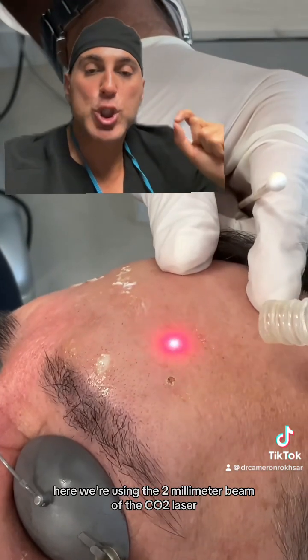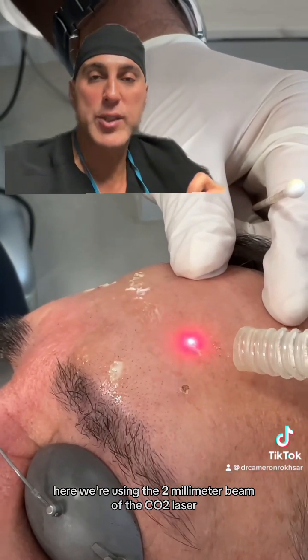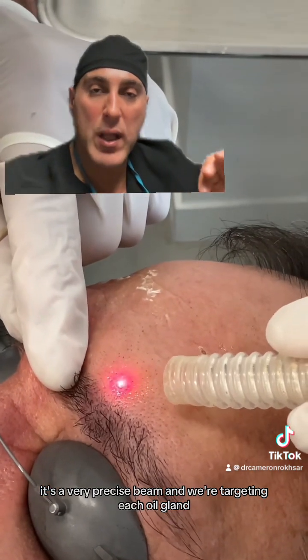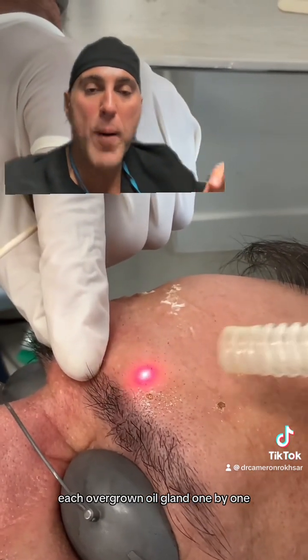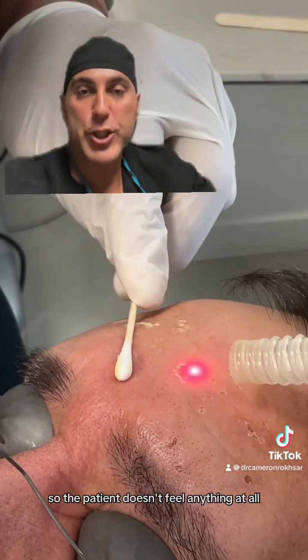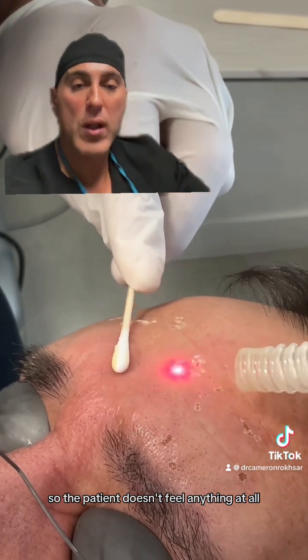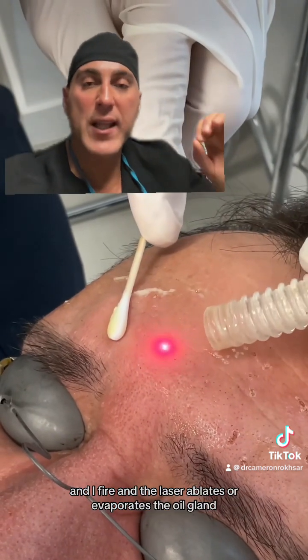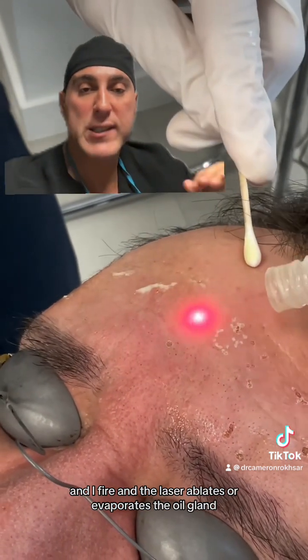Here we're using the two millimeter beam of the CO2 laser. It's a very precise beam and we're targeting each overgrown oil gland one by one. We've numbed the patient with a numbing cream so the patient doesn't feel anything at all, and I point the laser and fire — the laser ablates or evaporates the oil gland.